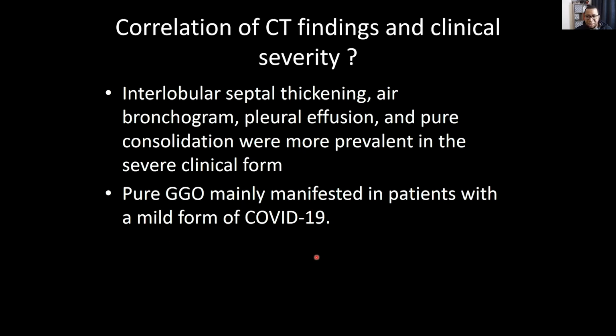So you see pure ground glass in a mild early form of COVID-19 before you have that disruption of the endothelial epithelial membrane and flooding of stuff into the alveolar space.